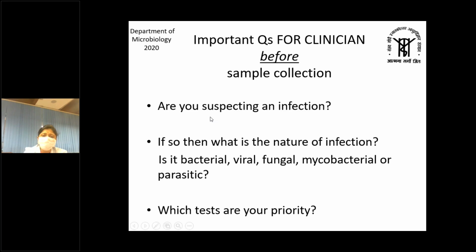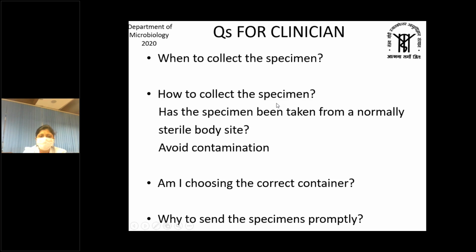Now, what are the few important questions for a clinician before collecting a sample for microbiology investigations? The first is, are you suspecting an infection? If there is an infectious etiology of maybe the fever that the patient is having, then you should consider an investigation for culture. If so, whether it is a bacterial, a viral, a fungal, mycobacterial or parasitic infection, which tests are your priority? After that, when to collect the specimen?